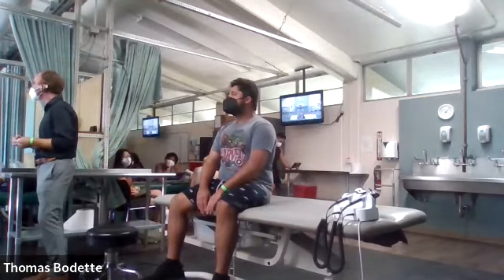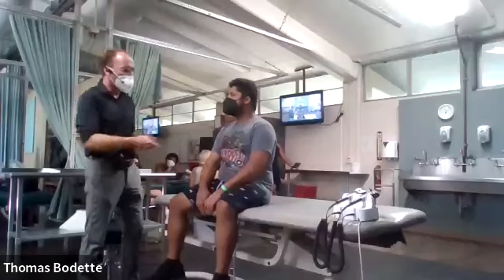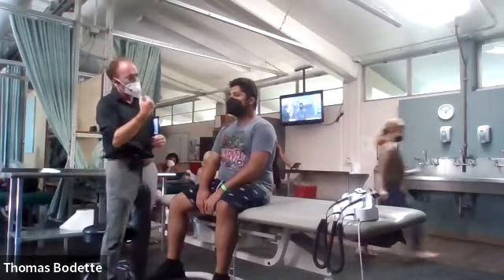Everybody okay? All right, Usman, I'm Dr. Baudet. I'm going to be taking my hands and making contact with your nose. I'm also going to use my instrument to look inside best you can. Just keep your head still when I tell you. Lower your mask and cover your mouth.